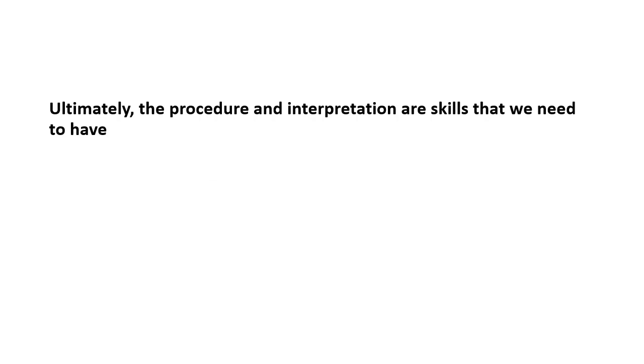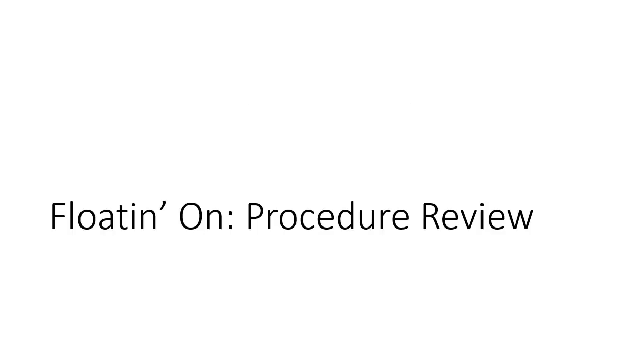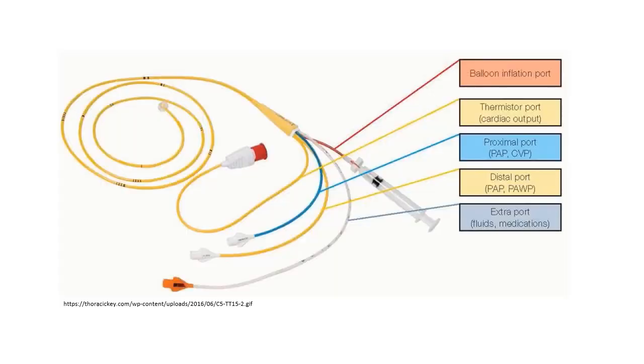So ultimately, the procedure and its interpretation skills, regardless of what you think about it, are skills that we need to have as intensivists. So, let's talk about the procedure itself. So, important to know your equipment. There's various brands that make different PA catheters, but essentially they're all pretty much the same. And a lot of them will use the same color conventions too, which is helpful.